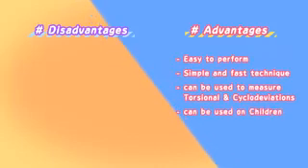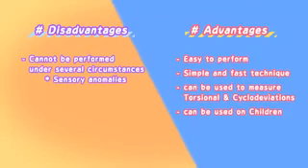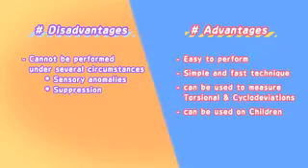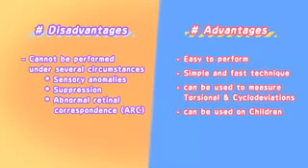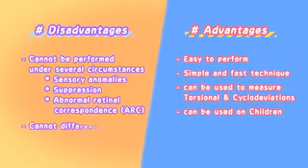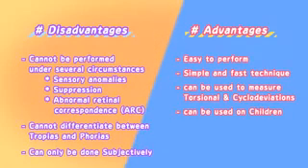Some of the disadvantages of the Maddox Rod test are: it cannot be performed if there are sensory anomalies present. It cannot be performed if a patient has suppression, as they will not be able to see the light. It cannot be performed if there is ARC, as the angle of separation of the images will not correspond to the angle of deviation, leading to inaccurate results. It cannot differentiate between tropias and phorias. It can only be done subjectively.